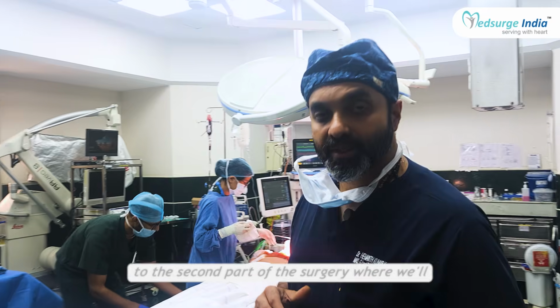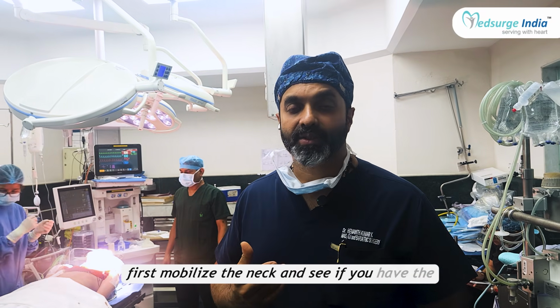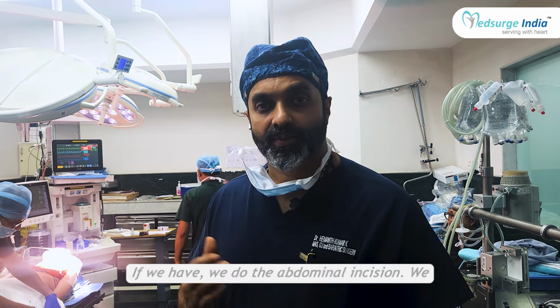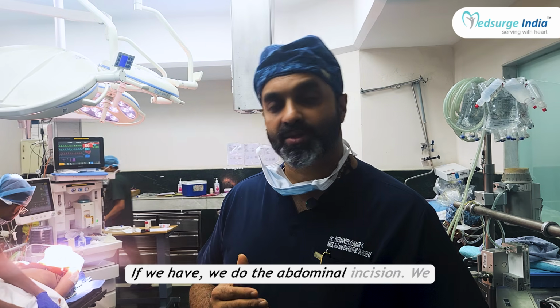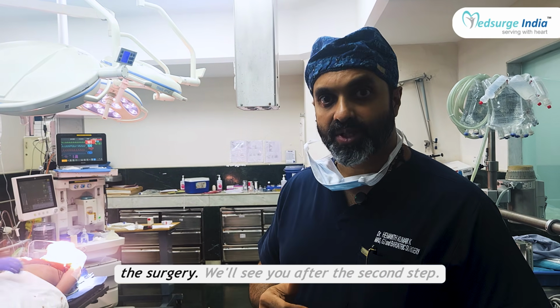Now we'll go to the second part of the surgery, where we'll first mobilize the neck and see if we have adequate length of esophagus for the anastomosis. If we don't have, we change our plan. If we have, we do the abdominal incision. We open up the abdomen and then go ahead with the surgery. We'll see you after the second step.